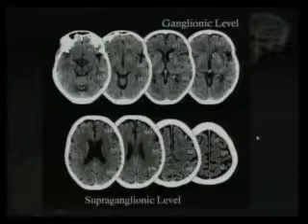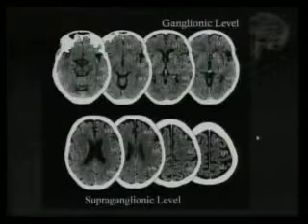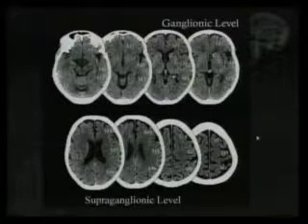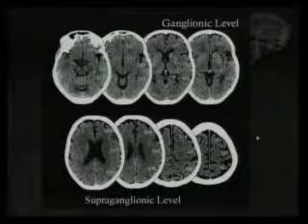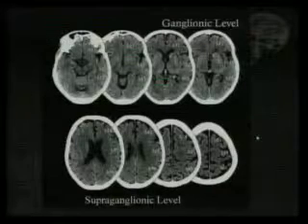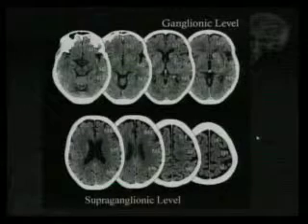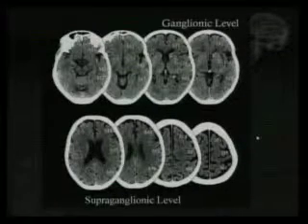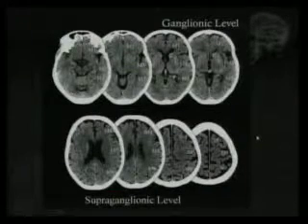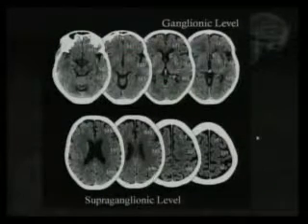And this is on the CT scan. So you have your cut. These are several cuts, so you look at everything. But let's say you have only this cut through the basal ganglia, so you're going to have caudate, lentiform nucleus, internal capsule, insula. Then anterior to that, your M1 or anterior frontal, M2 lateral MCA, and M3 posterior MCA. And then you go to the corona radiata, centrum semiovale, and you have 4, 5, 6, anterior, lateral, and posterior. Those are the segments you want to look at.